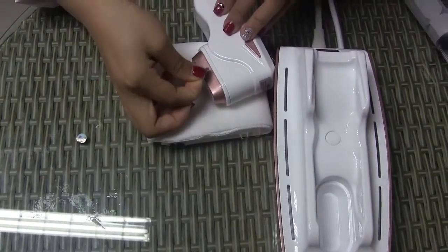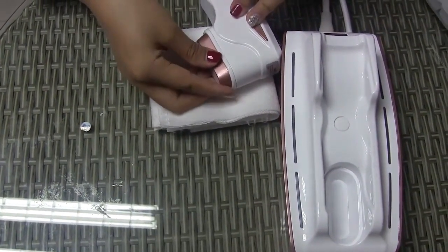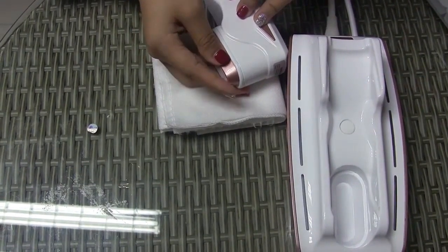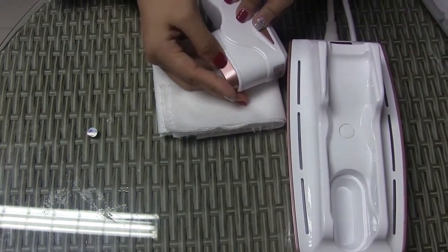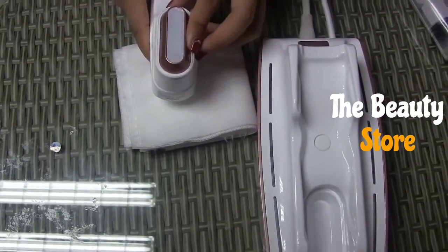Put on this. And press it. Okay, that's how to inject the water. And now let's see how to change the membrane.